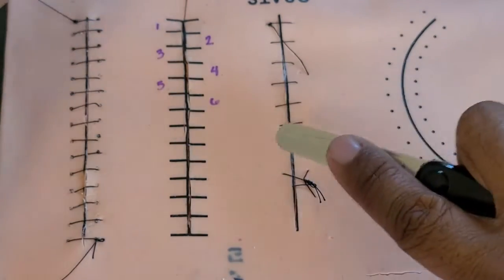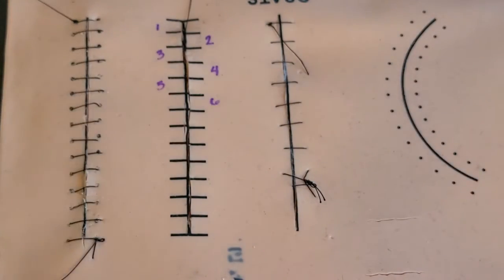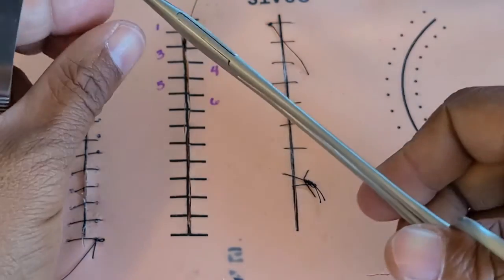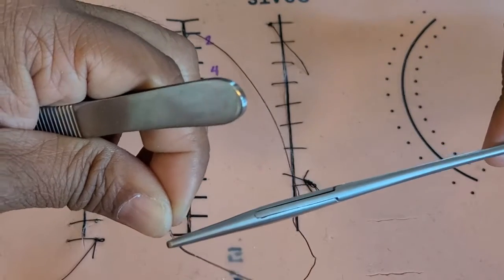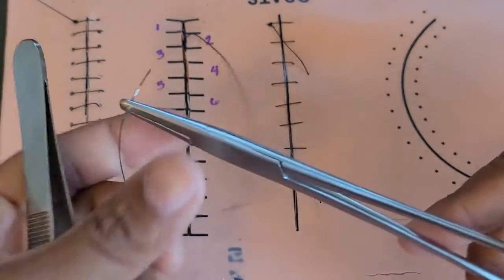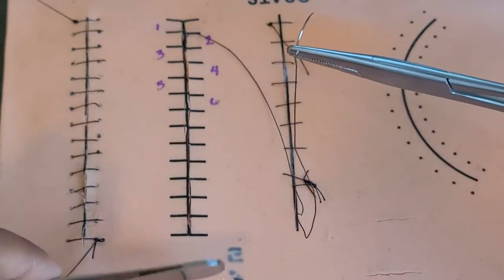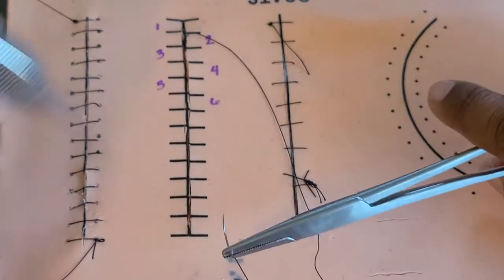With your scissors, you cut the excess off and reload your needle. A lot of people will do this backhanded depending on where you're standing. Sometimes you do not have to backhand it, but since I am standing at the base of this incision, I will often backhand it.